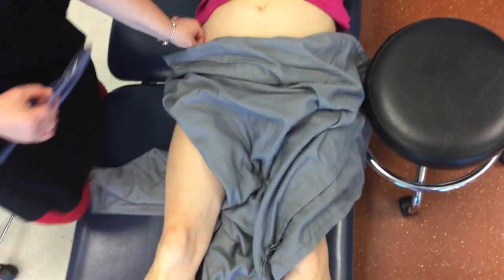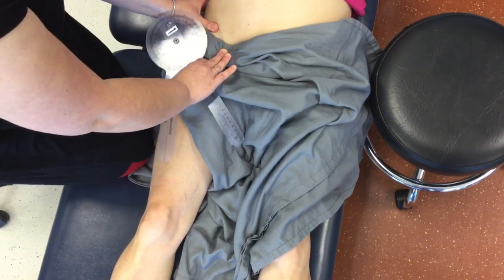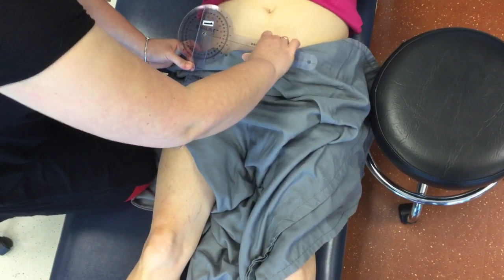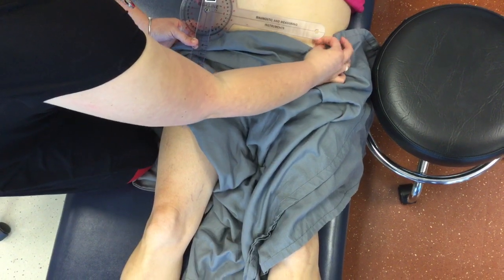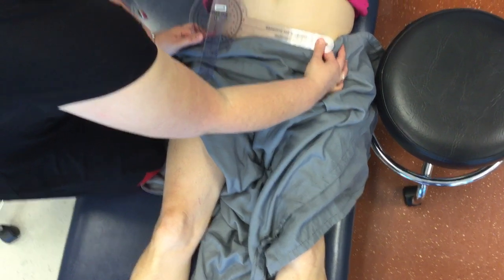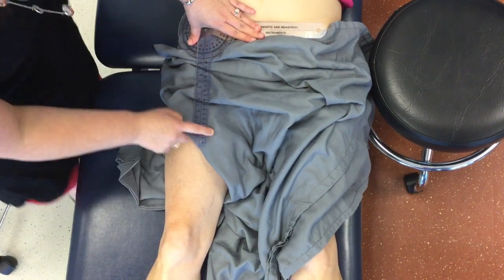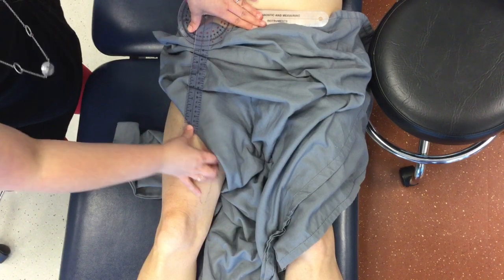Center the fulcrum of the goniometer over the anterior superior iliac spine of the extremity being measured. Align the proximal arm with an imaginary horizontal line extending from one ASIS to the other. Align the distal arm with the anterior midline of the femur using the midline of the patella for reference.